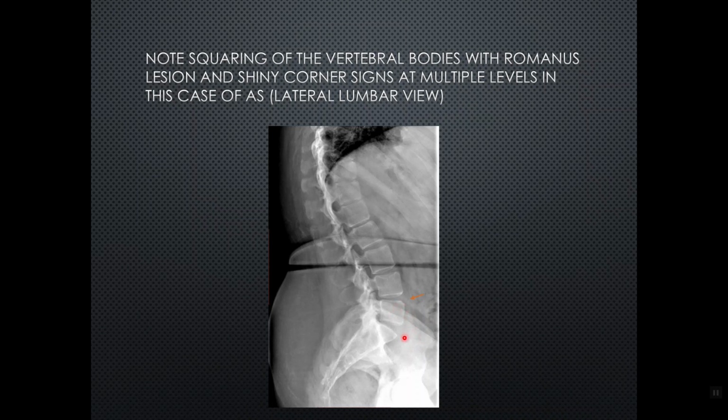And in fact, if it's not, then MR imaging is most likely to demonstrate it. So in this case, MRI may be helpful for you to further delineate the diagnosis and perhaps confirm the diagnosis of ankylosing spondylitis, in addition to history and some of the lab tests.